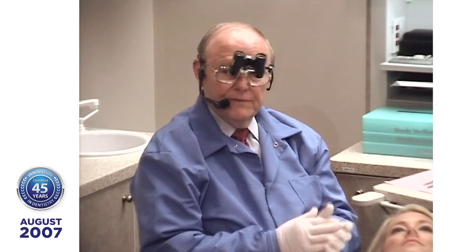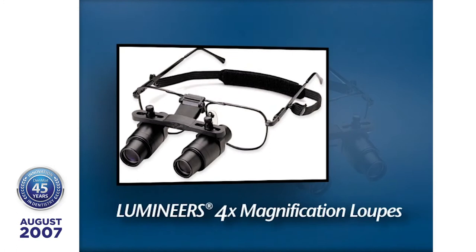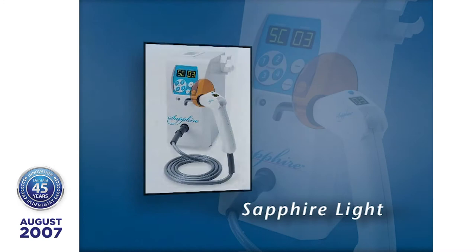How many of you use magnification? I'm using four-power magnification, working on a patient that's not anesthetized — I want sharp vision. You're going to watch me place these 10 porcelain veneers in about one minute with the sapphire light. Gordon Christian said working without a sapphire light is like working with a slow-speed handpiece. The next tip is taking a good impression.